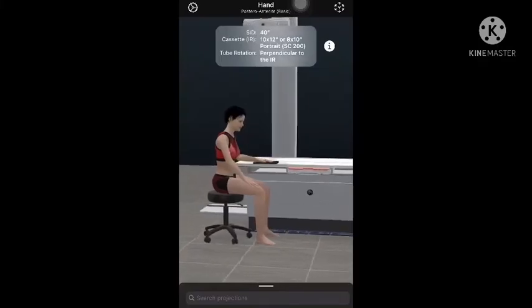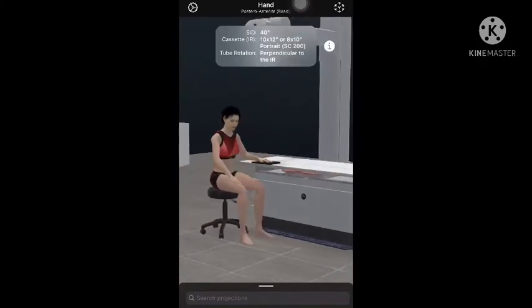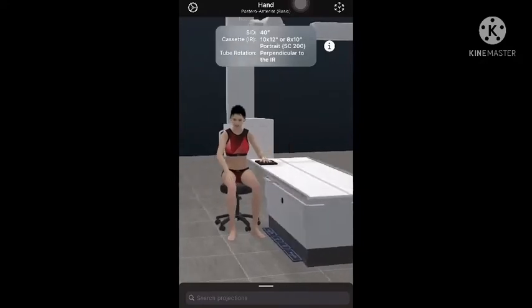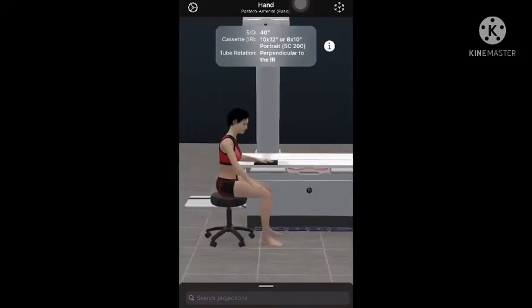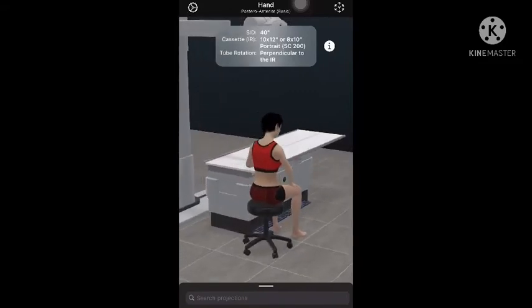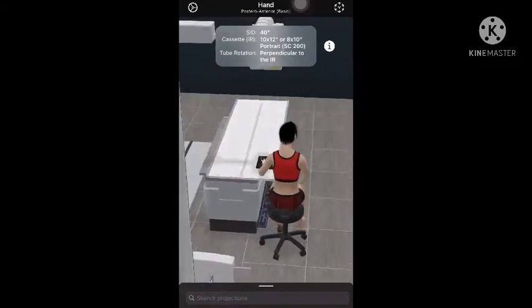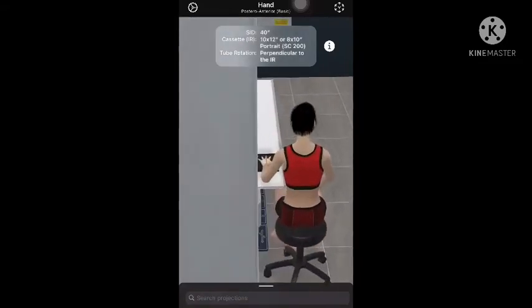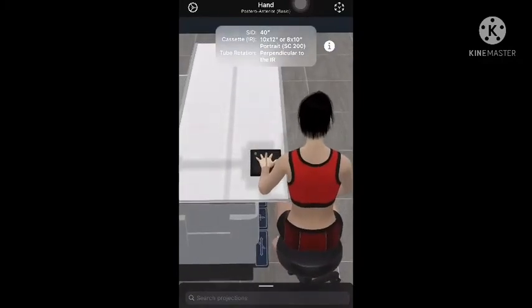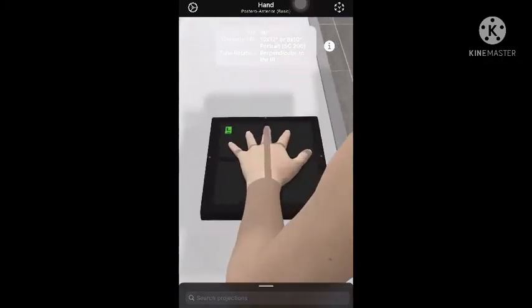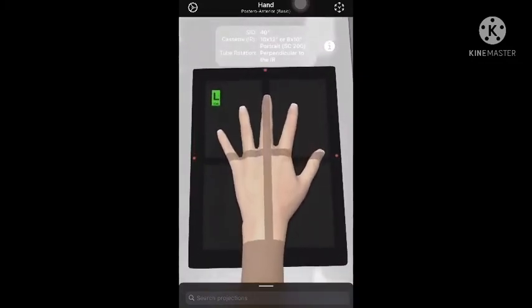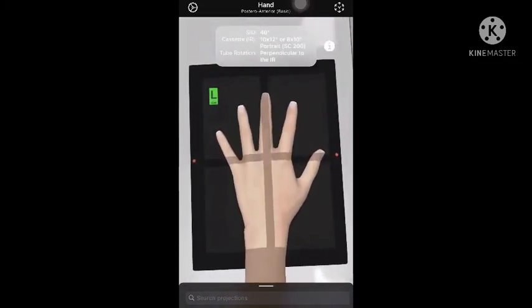As you can see, the patient is at the end of the radiographic table, seated sideways. When positioning the affected hand, adjust the long axis of the hand and forearm parallel with the image receptor's long axis, and direct the central ray to the third MCP joint perpendicularly.